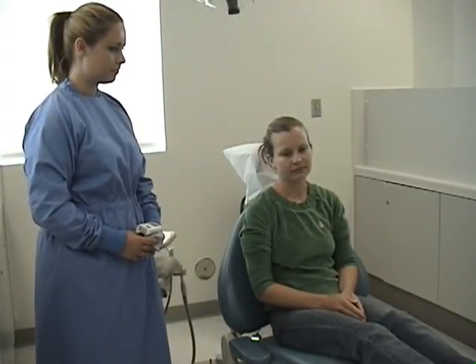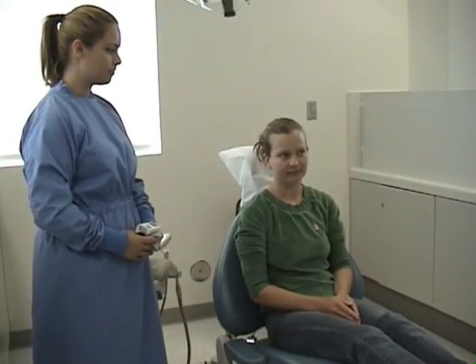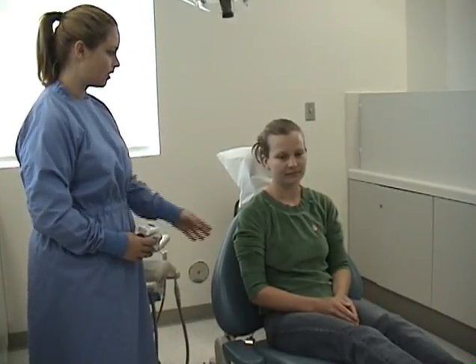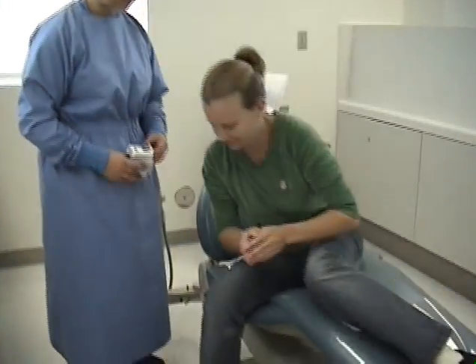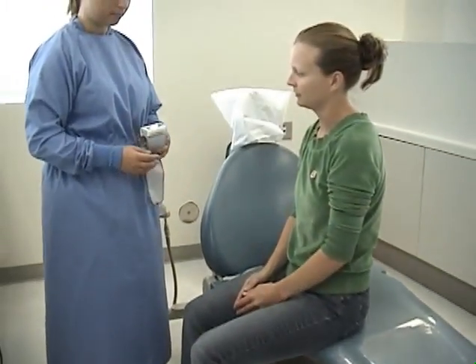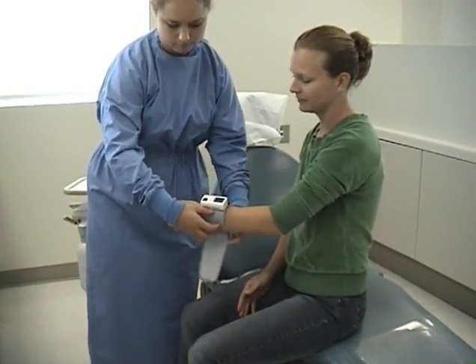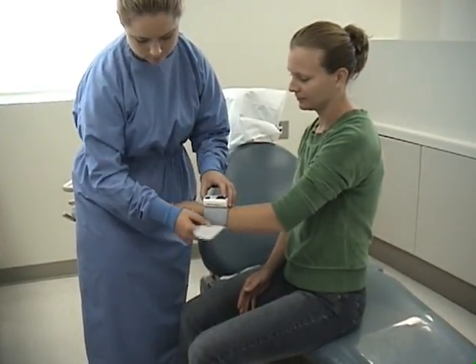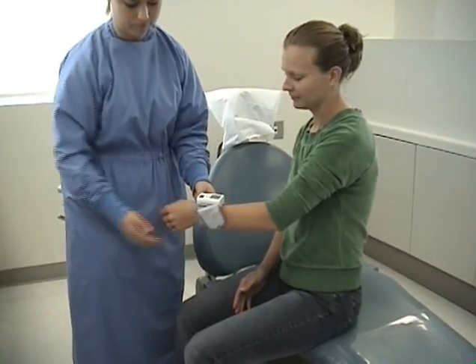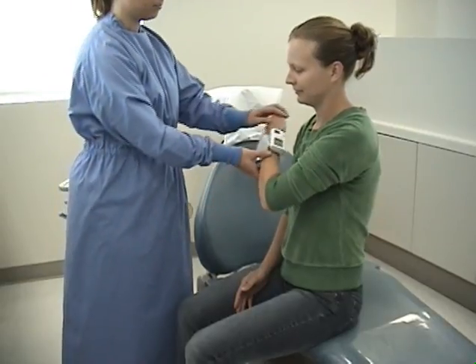We're going to begin with the blood pressure. Position the patient in the upright position with their feet flat on the floor. Place the wrist cuff on the patient's non-dominant wrist with the thumb pointing up, one-fourth inch to one-half inch from the patient's wrist. Direct the patient to position their non-dominant hand across their chest.